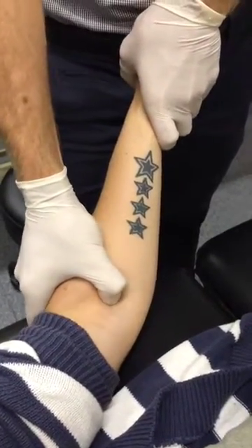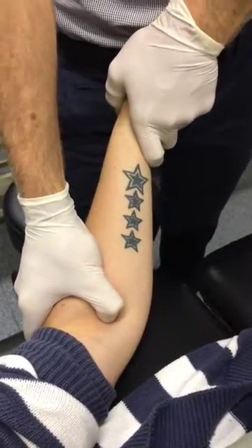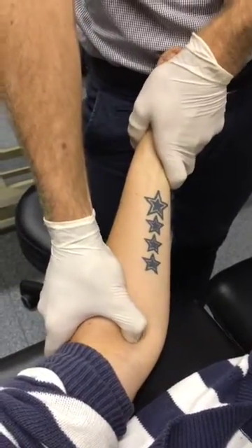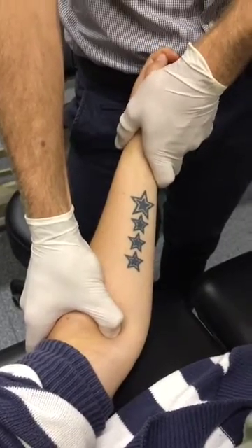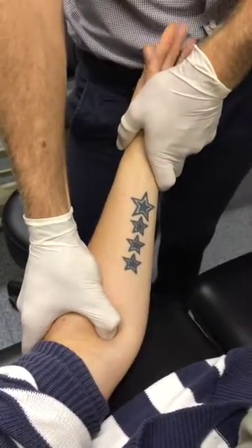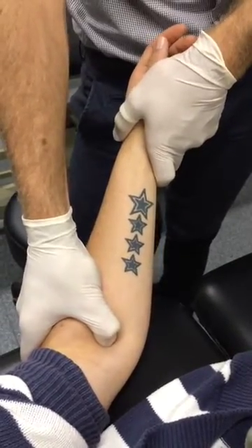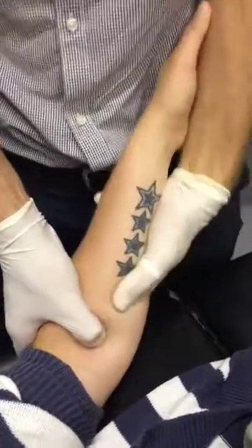Go again. Yep. There's not really anything else that will come up with that, as long as they're not sort of pushing into a bit of pronation as well — which she wasn't, so just be aware of that. And also what you can do just to make sure — I feel like I'm on the muscle there — just wiggle your fingers, and I'm not feeling any contraction through flexor digitorum profundus or digitorum, so it just sort of tells you which one you're on.